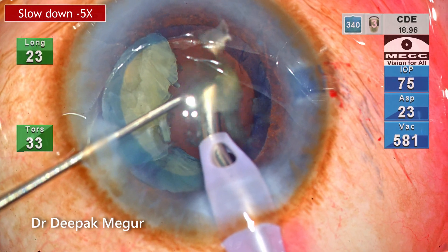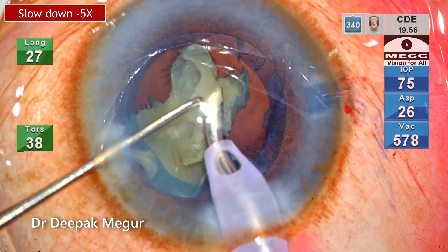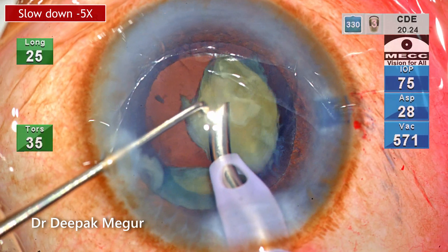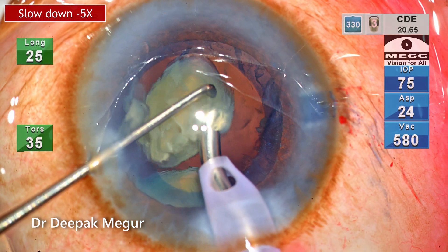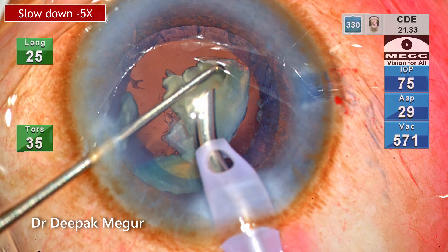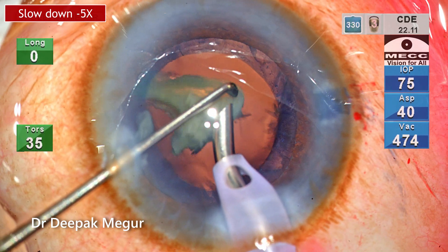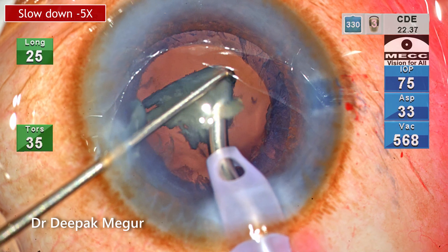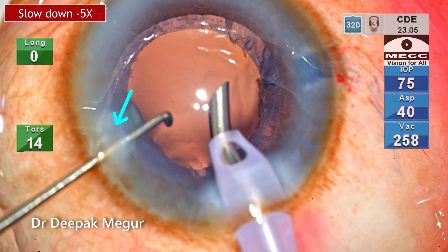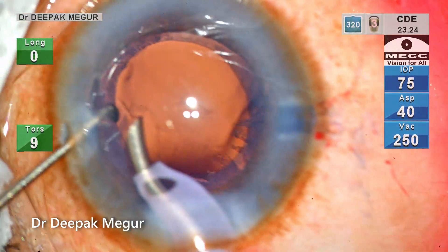The plane of emulsification is extremely important — I stay conscious not to come anterior or above the pupillary plane. The second instrument also plays a great role in maintaining this. The nuclear fragment rotates in the bag, and part of it must remain within the bag during emulsification — this ensures minimal trauma to the corneal endothelium. The last fragment is aspirated out; one tiny fragment will often stick at the side port entry, so I always note it and remove it immediately.